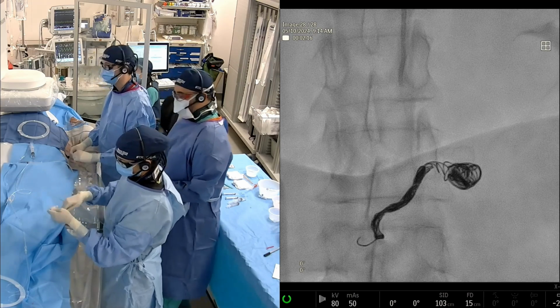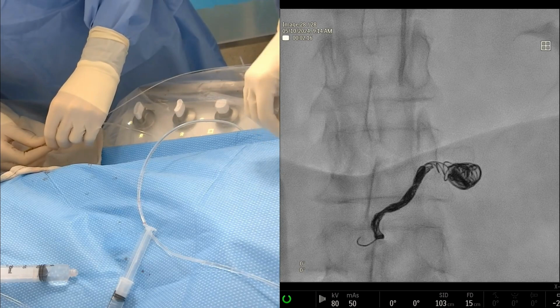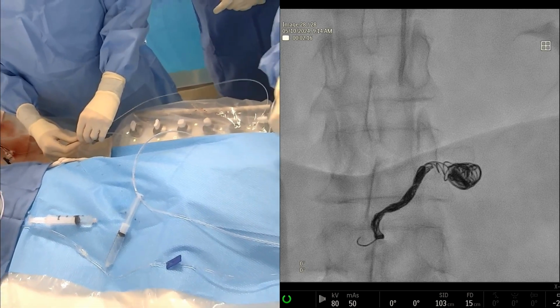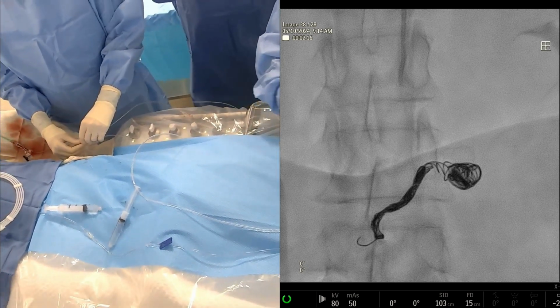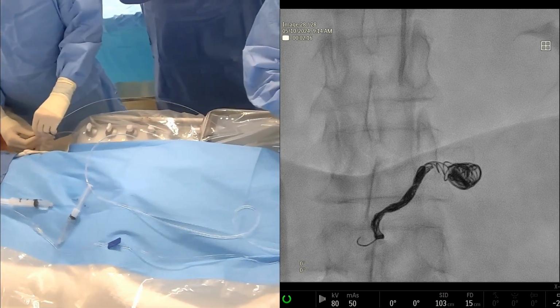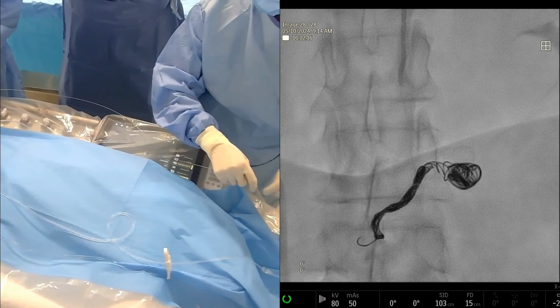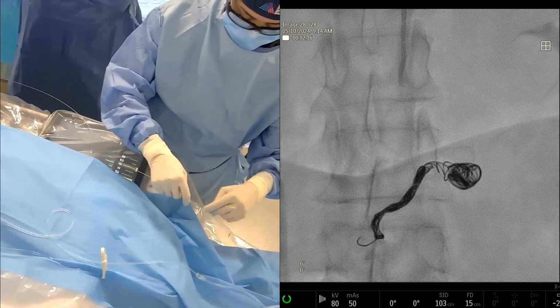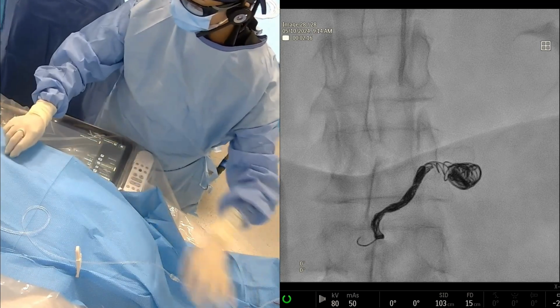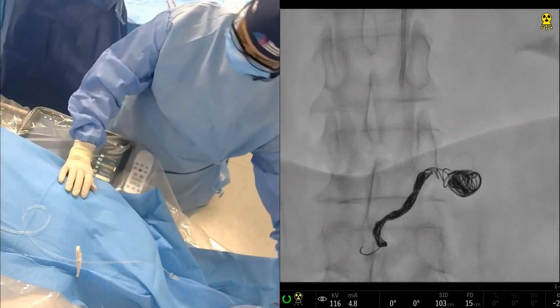So this is sort of a different question, right? In aneurysms, do the fibers count? Because I think classically we have used what neuro uses in terms of packing density, in terms of how much metal needs to be within the aneurysm. Fibers typically didn't count. I think there's some data from Penn that maybe the fibers do help. But I think if you underpack the aneurysm, even with fibers, you can end up with something called coil compaction. So I still like to see a dense coil pack.